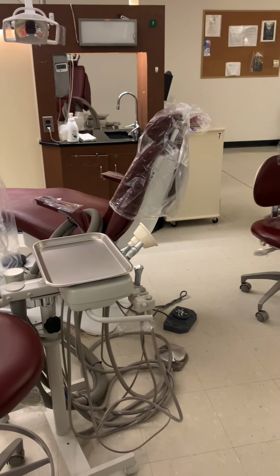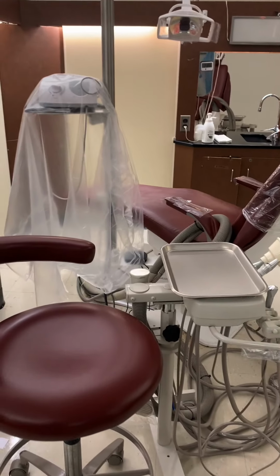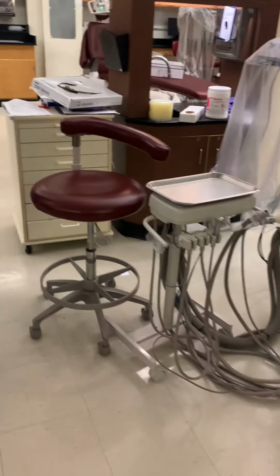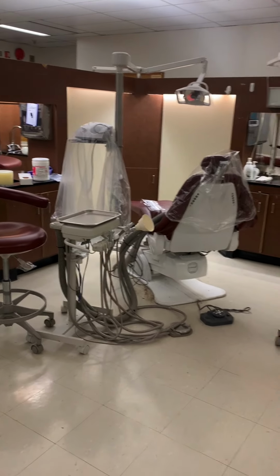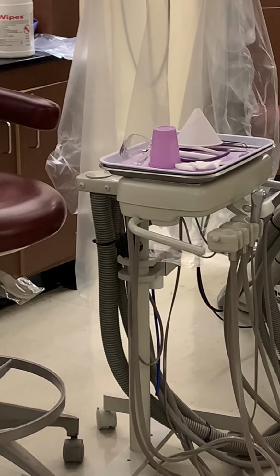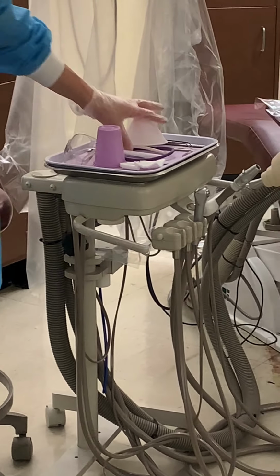Let me grab gloves for that. Such a bad photographer, in everybody's way. Grab my instruments. Let's say you have a room with a bunch of these already set up. This goes into your room. This is, oh sorry, I didn't barrier here. You guys need a barrier on this as well. Okay, this is a barrier.